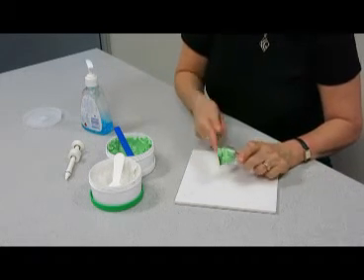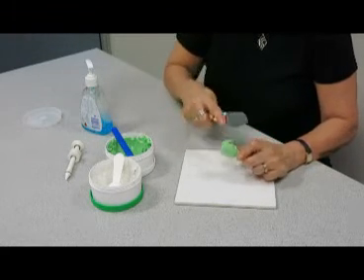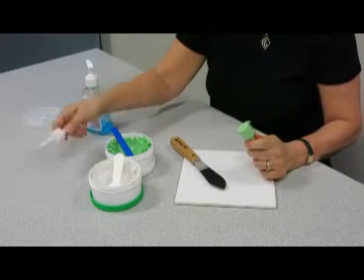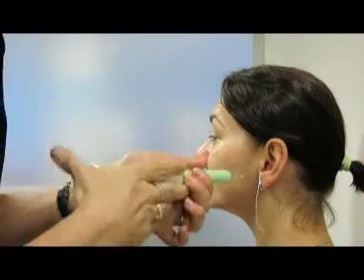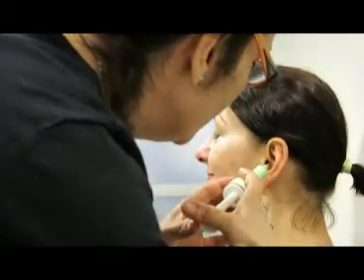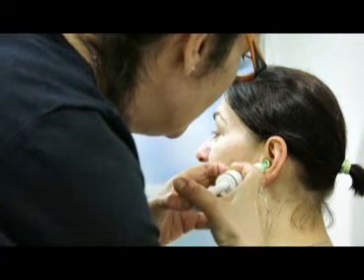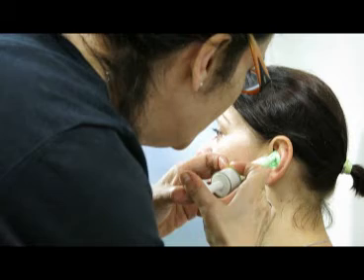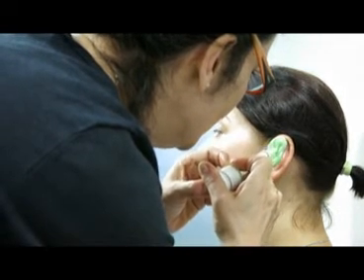Put the impression material right into the syringe. You don't even have to use your fingers if you don't want to — it's all a matter of taste. And then you're ready to syringe. Squirt out a little bit, and then put the syringe all the way to where the foam block is. Stay into the contour and then start moving up. Always stay in the impression material — don't go out of the impression material. And there you go.